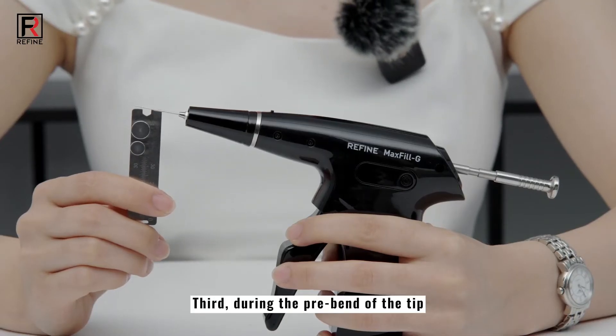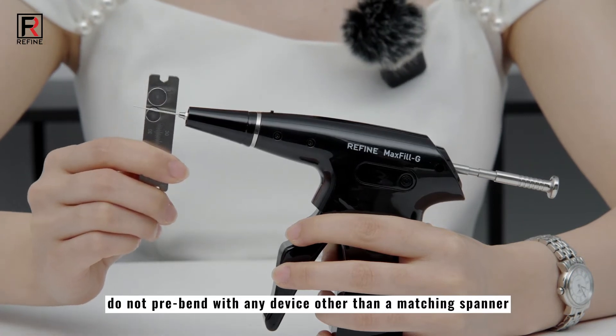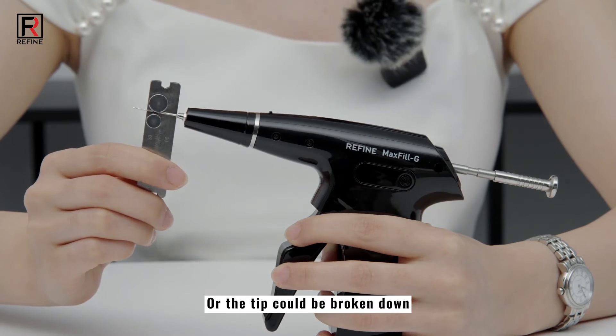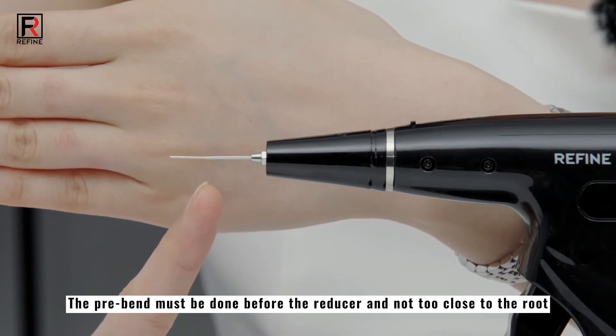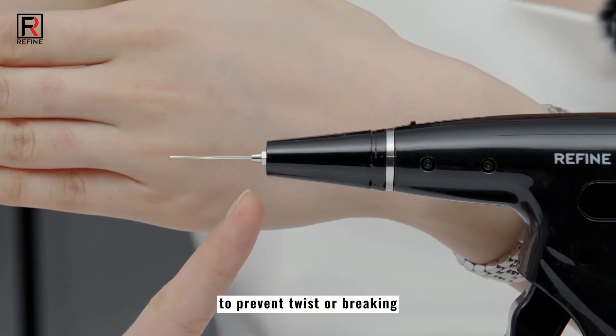Third, during the pre-bend of the tip, do not pre-bend with any device other than a matching spanner, or the tip could be broken down. Also, please note the pre-bend must be done before the reducer and not too close to the root, to prevent twisting or breaking.